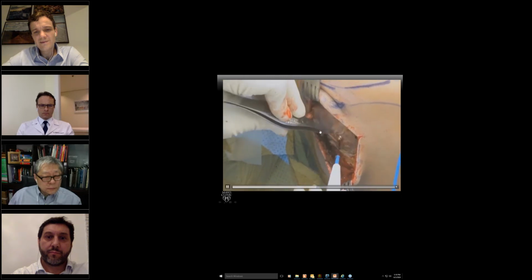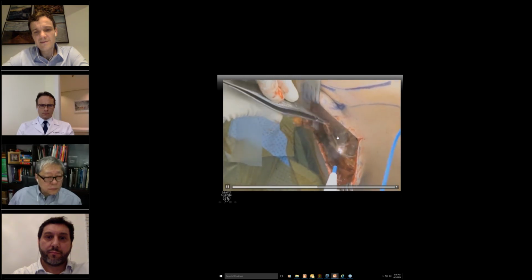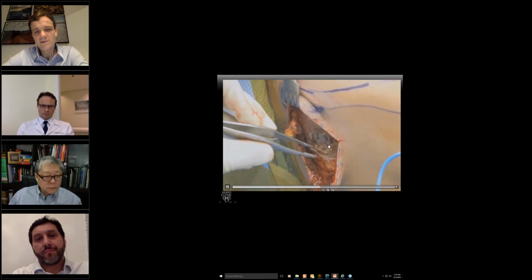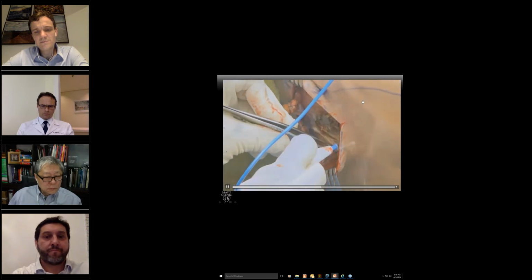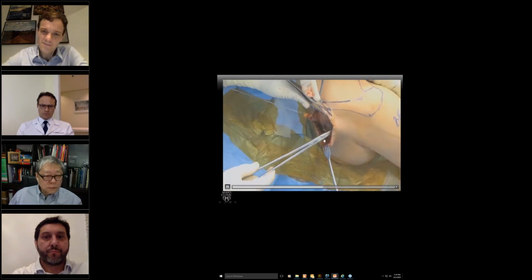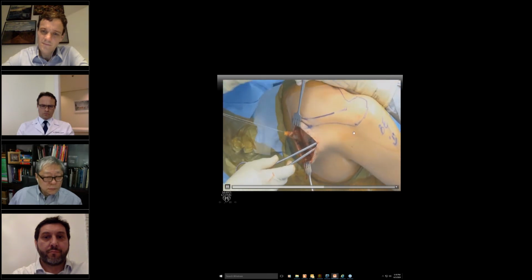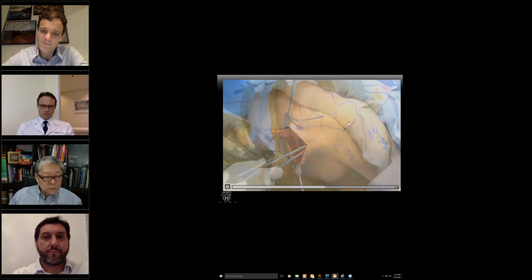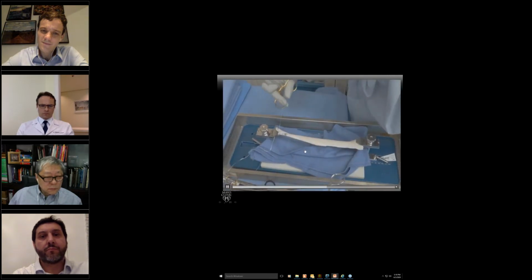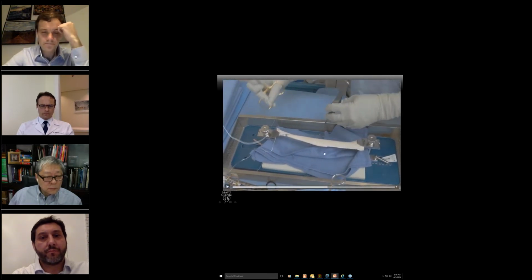And you can see here, there's no fat, no muscle, there's nothing. In fact, you can see the scapula bone. There's no muscle at all, which is bad. Like she has no muscle. So once you do this, this is the opening, and this is what we show all the time. If you go here, that's it. You go between deltoid and infra, you're in the subacromial space because you are between the deltoid and the infraspinatus. Now, this step of the case is always in the beginning.